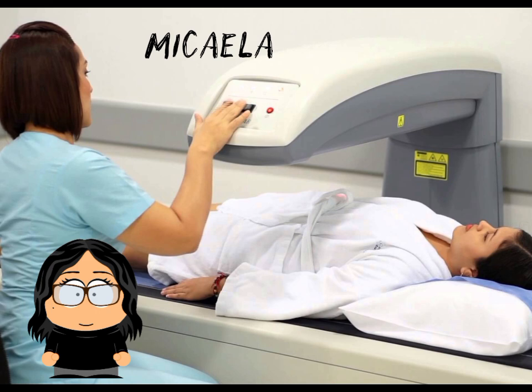The patient lies on the table while an X-ray generator slowly passes over the area to be examined, usually the hip or spine. The test lasts approximately 15 to 30 minutes, and the patient can resume normal activities immediately afterward.